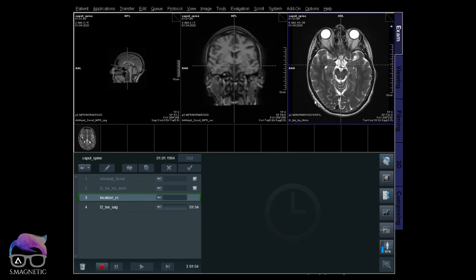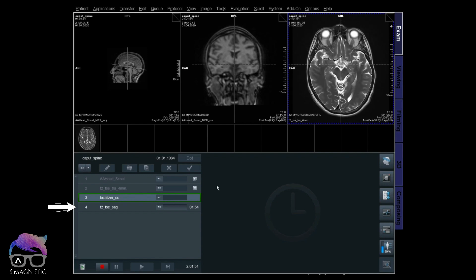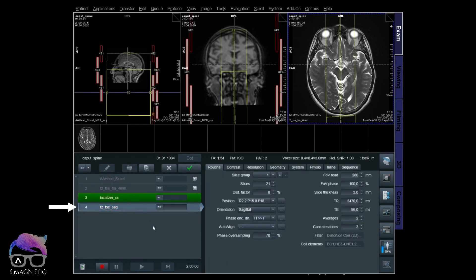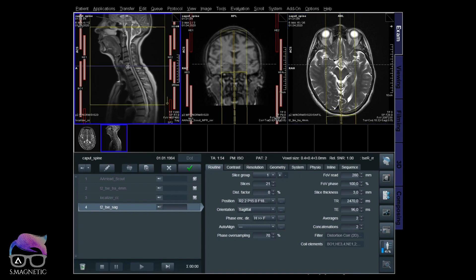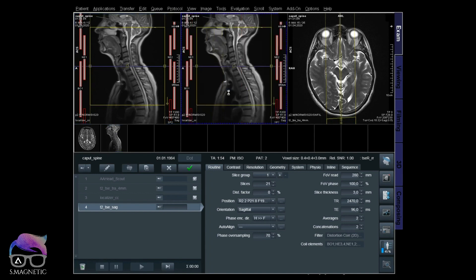The head scan is finished. I have the T2 weighted sagittal ready - number four in the line. I have to wait for the localizer. For everything at the spine I'm using ISO because I want to be in the middle of the scan at all times, and this area is very large, so reference or fix would be very difficult.